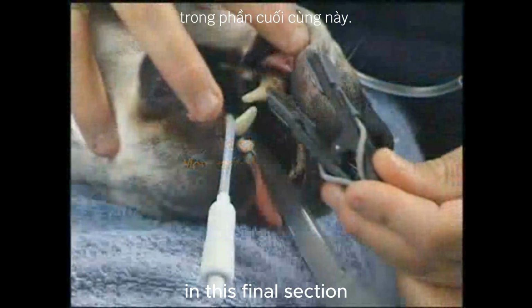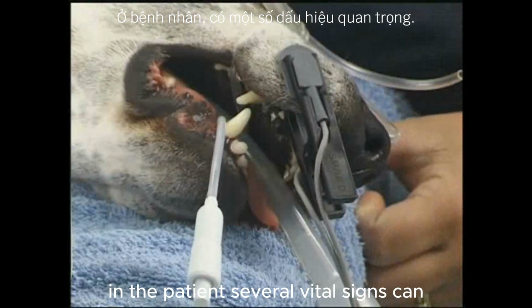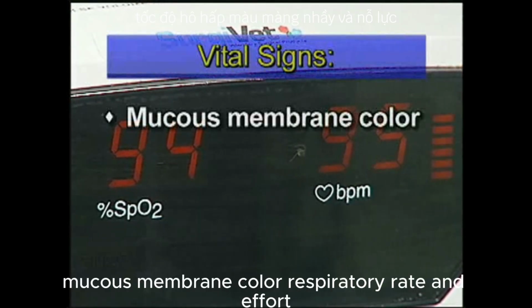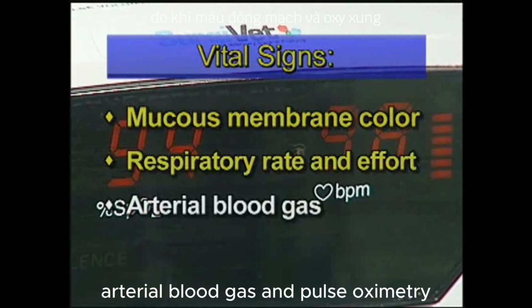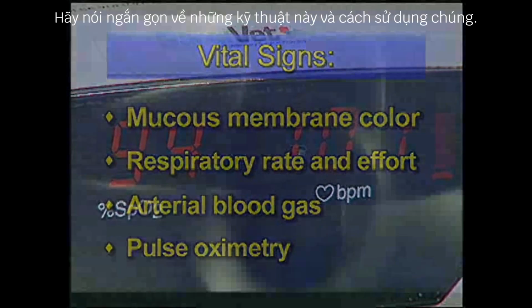In this final section, we will discuss the importance of monitoring the success of oxygen therapy in the patient. Several vital signs can and should be monitored during oxygen therapy. These include, but are not limited to, mucous membrane color, respiratory rate and effort, arterial blood gas, and pulse oximetry. Let's briefly discuss these techniques and their uses.